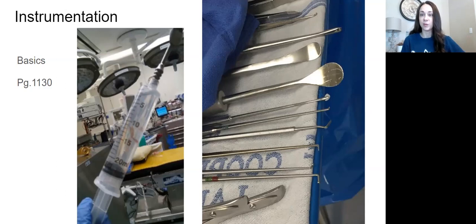This is more old school, it's a handheld crank. Now, do we still use this? Yes. There are situations like patients in the ICU. We can't run up to the OR, get the piece of equipment and the handpiece to drill in the ICU. We don't have time for that. This is emergent. We need to get into the head as quickly as possible. That's what this Hudson brace is used for.